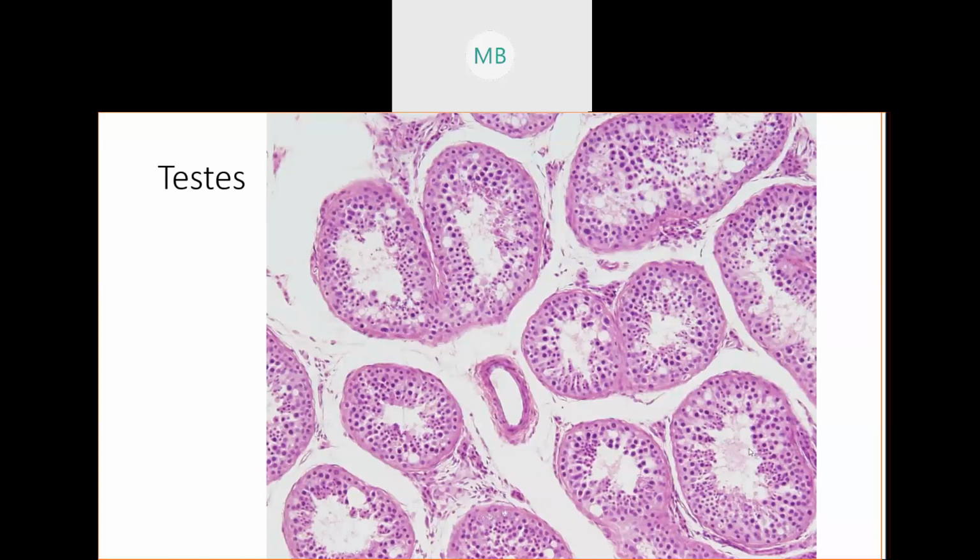So if you're looking at this and it looks like you're observing a series of tubes and some of these inner cells seem to have stringy tails here, congratulations, you're looking at sperm. This is a testis, right? Testes make testosterone, and you are looking at tubes creating sperm.